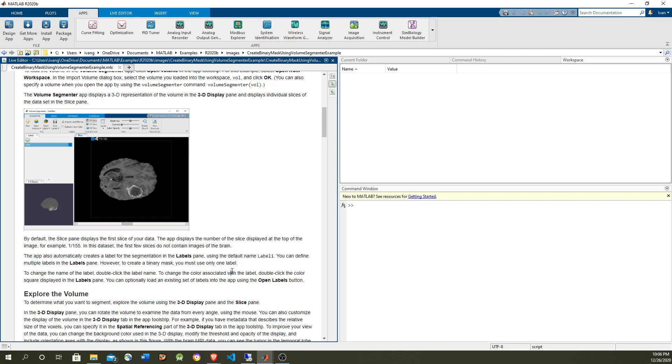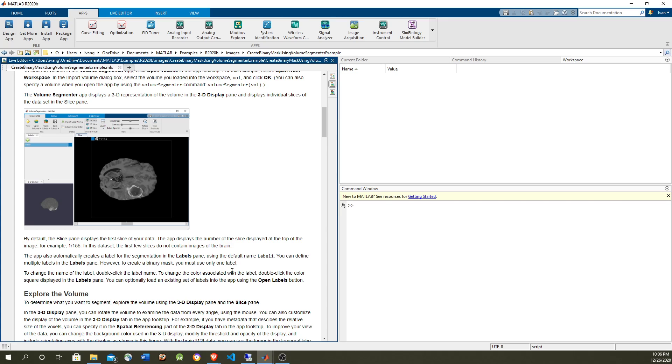In this video I'm going to show how to create a binary mask for a volume using the volume segmenter application from MATLAB. This is going to be used to label which parts of the MRI brain image have a tumor and which ones do not. One of the purposes of this is providing data to train another network to automatically detect where a tumor is within a brain MRI image.